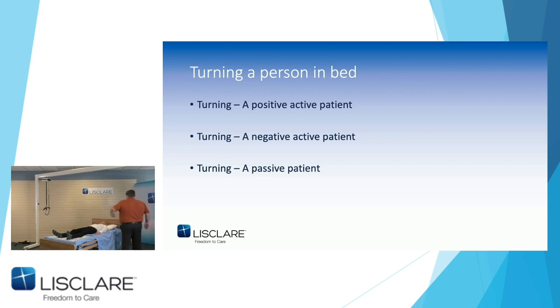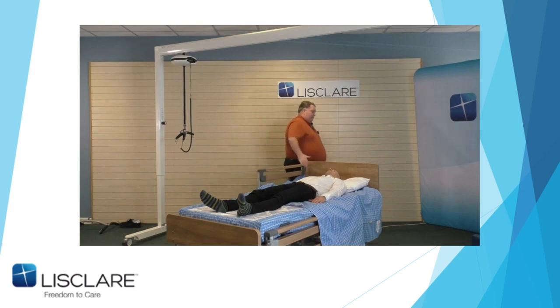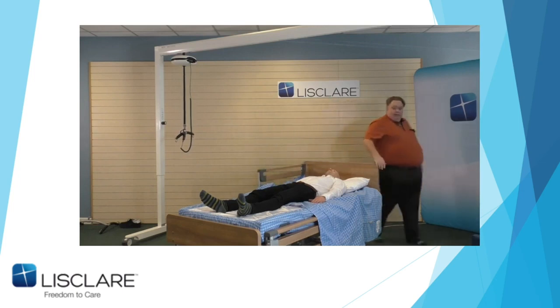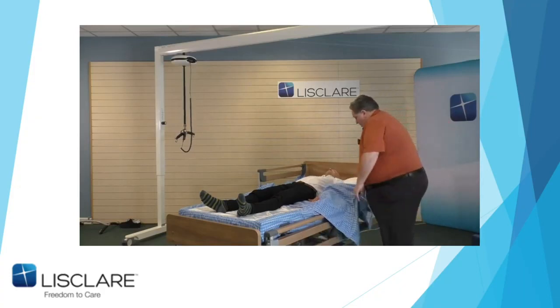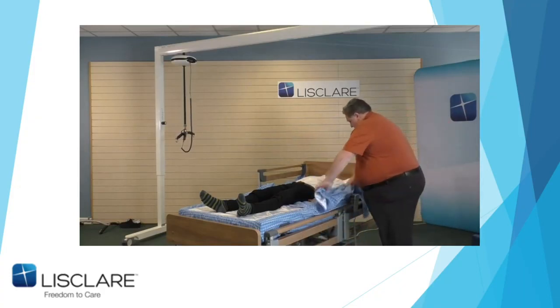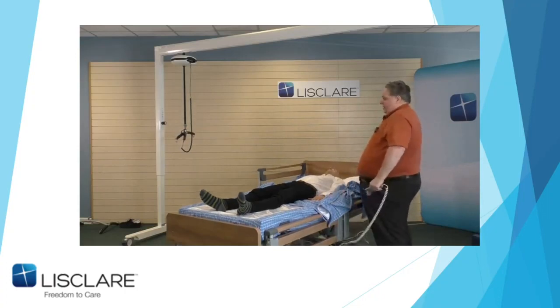At this point, because I'm going to be working from this side, I'm going to lift the one side rail up on this side, which is enough for me. So there's the side rail up. You would untuck the sheets if you've tucked it underneath the mattress. And now there's a couple of ways of doing this, and I'll go through this with you. First thing again, bed up to the next working height for me.